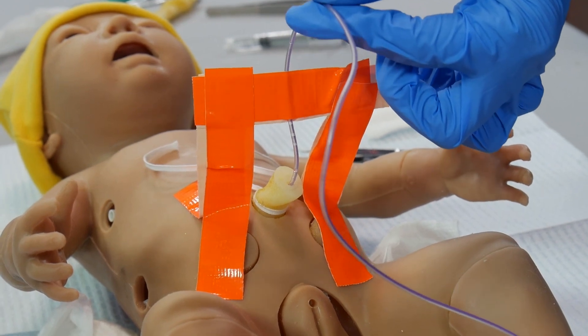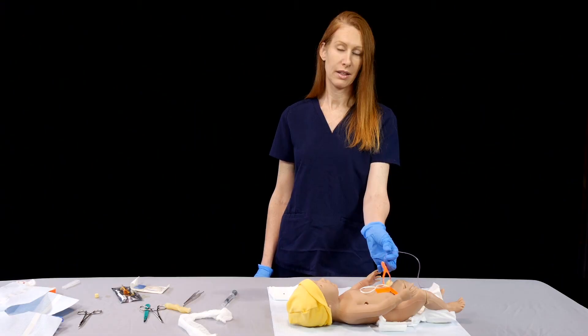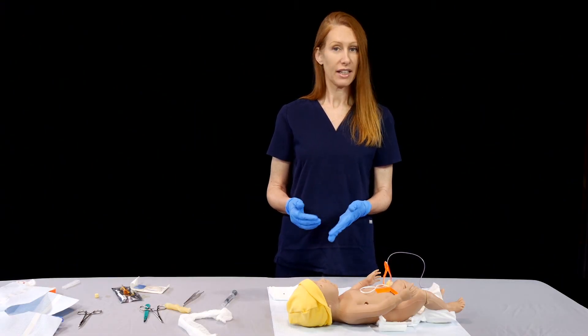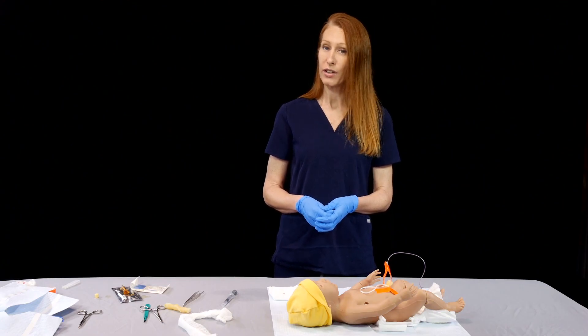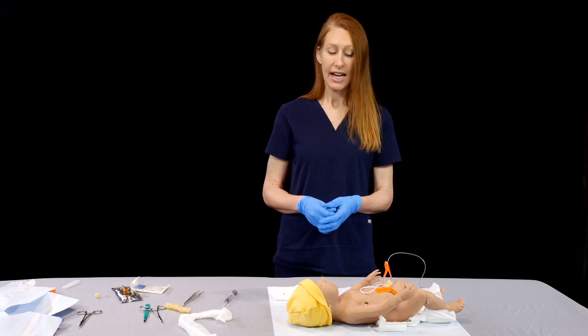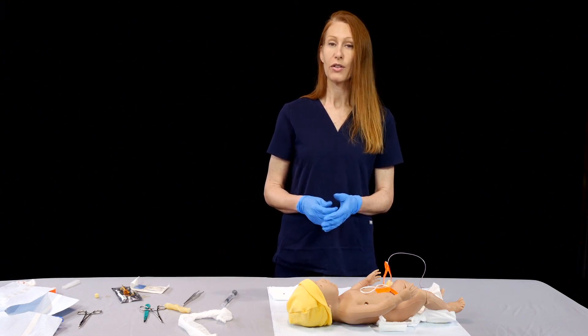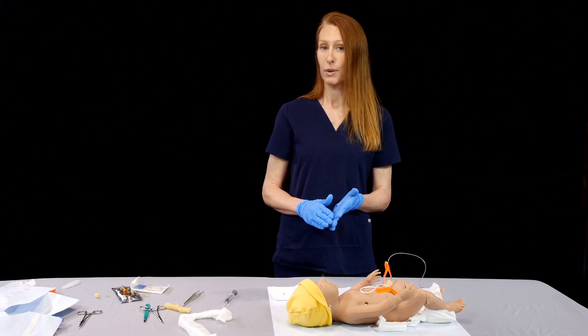If this gets tugged on gently, it's still well secured within the baby, and now you're ready to use your umbilical line. It does not require any radiographic confirmation as long as you're able to withdraw blood and it's not in past five centimeters. This can be used for anything that you need to infuse: dextrose, epinephrine, fluids.